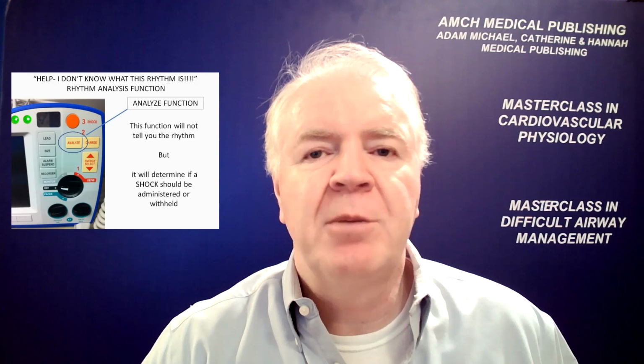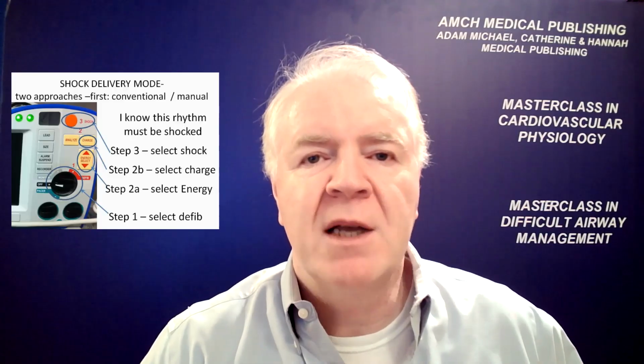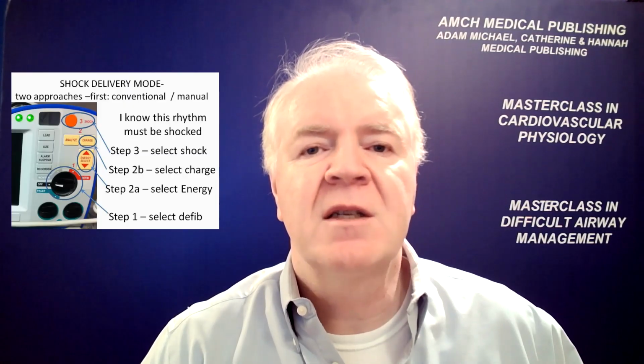If there is ventricular fibrillation or ventricular tachycardia, a shock will be advised. Select an energy of 120 joules, press charge, press and hold the shock, wait for up to 10 seconds, a shock will be delivered. This is defibrillation. Now assume you choose cardioversion, that is a synchronized shock.